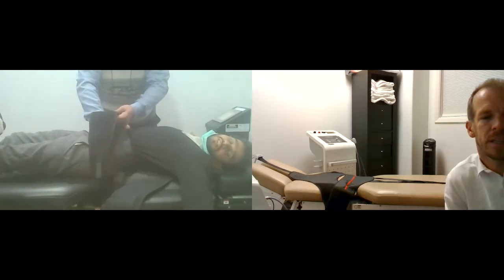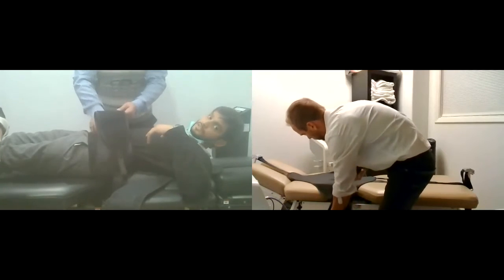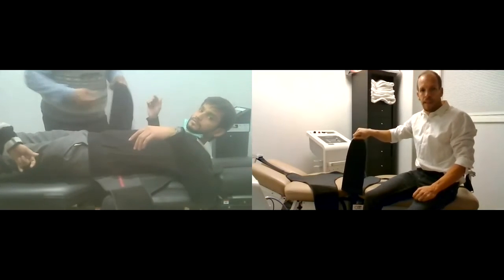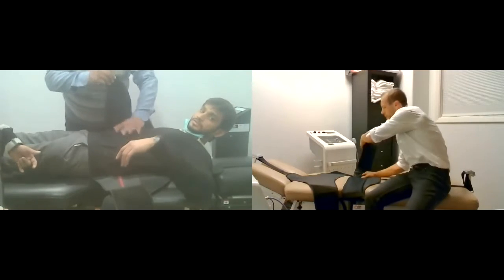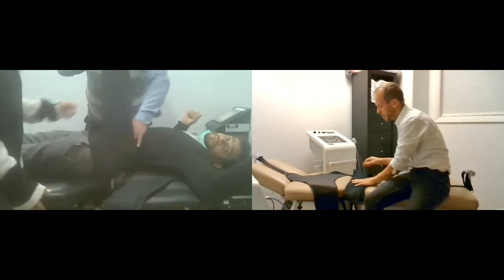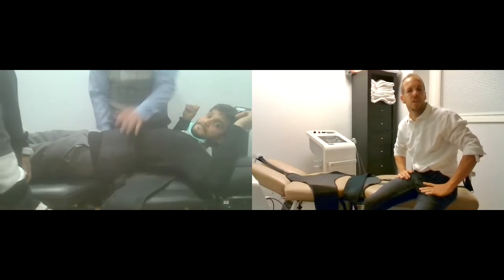That looks good. Now, the easiest way to do that is to grab this one with your right hand, tuck it under, reach across with your left, get your hand out of the way, and then pull this straight across. It should be pretty tight.